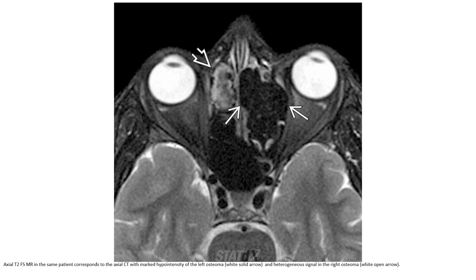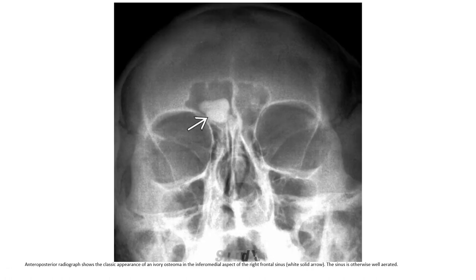T2 fat-saturated MRI in the same patient corresponds to the axial CT, with marked hypointensity of the left osteoma and heterogeneous signal in the right osteoma. Plain radiograph shows the classic appearance of an ivory osteoma in the inferior medial aspect of the right frontal sinus. The sinus is otherwise well aerated.